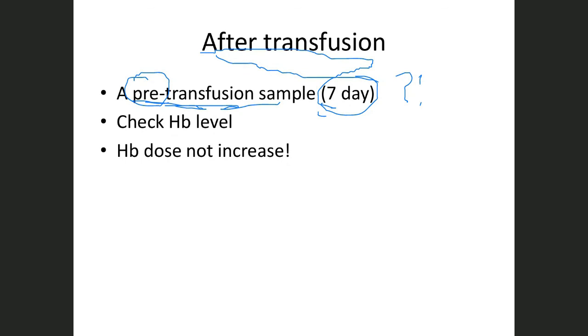In case a problem happens. Post-transfusion, we still need the pre-transfusion sample. In case of what, do you think? Excellent, Lulwa. In the blood bank refrigerator we keep it for 7 days, because maybe the patient suffers from a hemolytic transfusion reaction, isn't it? Or a complication.